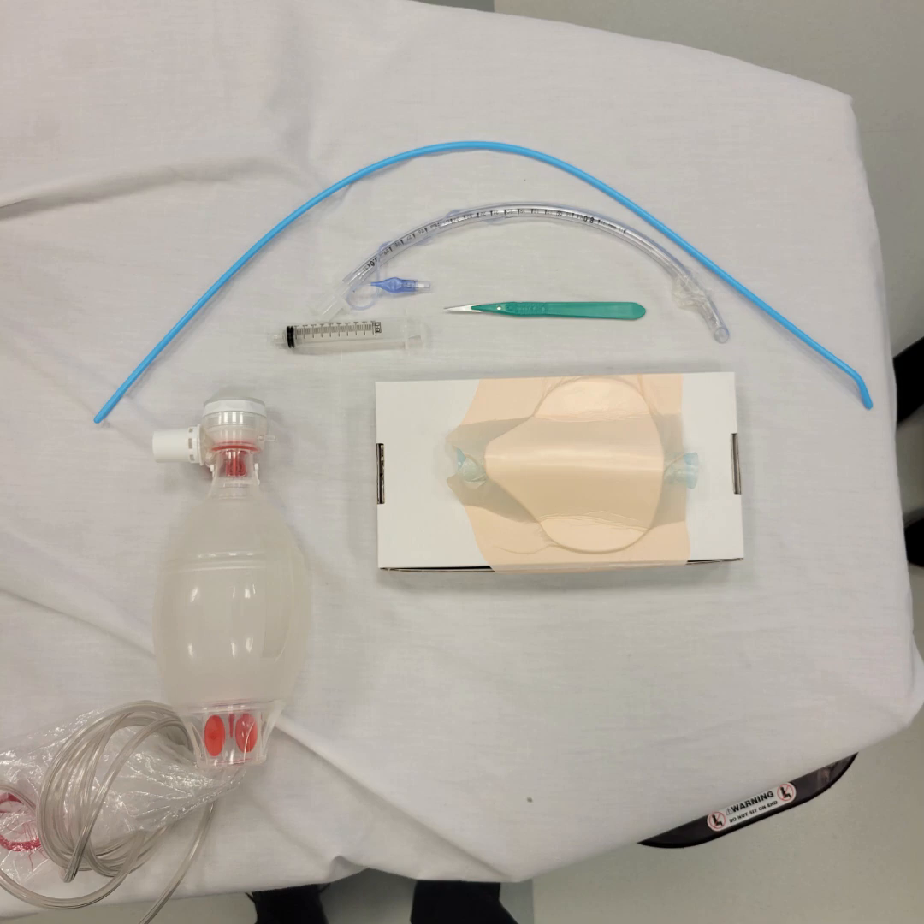For this technique, you'll need an ET tube and a syringe to inflate the balloon, a scalpel, a bougie, and a BVM.